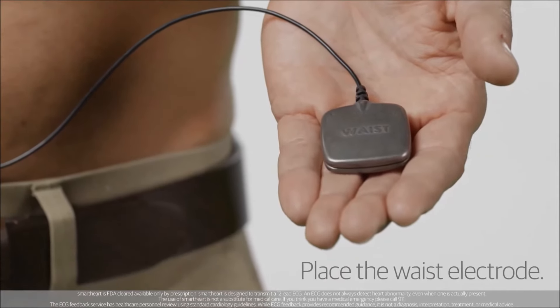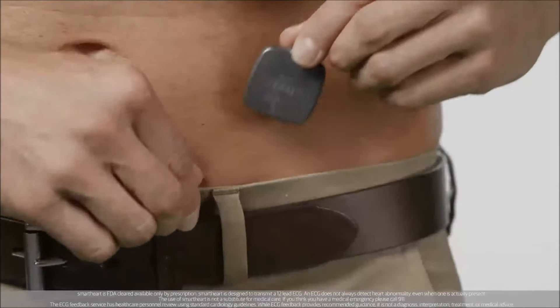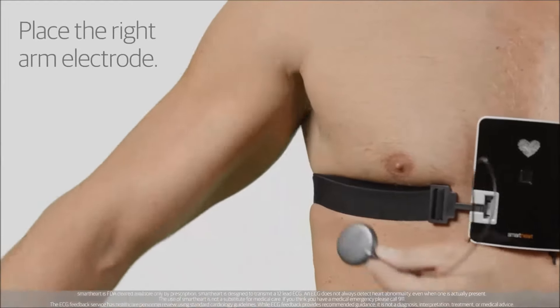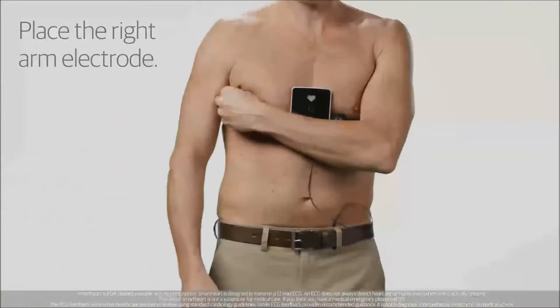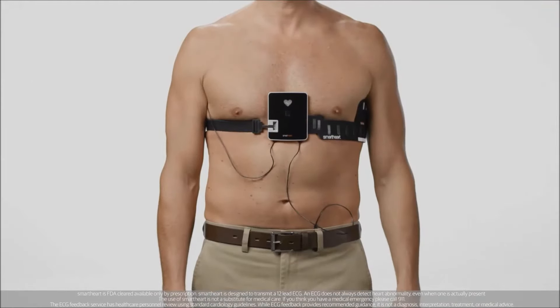Next, take the waist electrode, which is square, and place it at your belt line against bare skin, halfway between your belly button and your hip bone. Position the right arm electrode in the armpit under the right underarm against the skin.